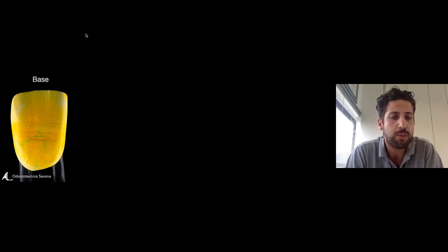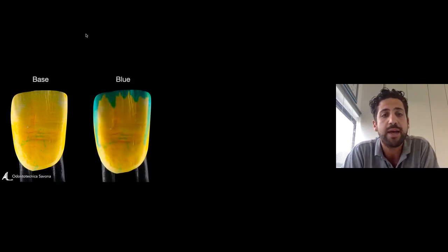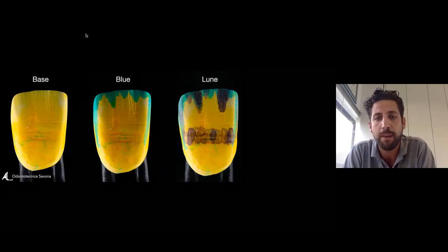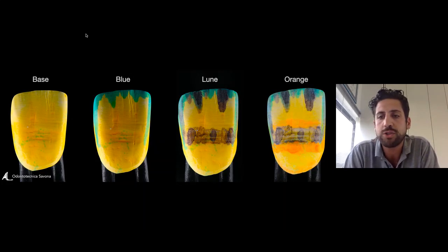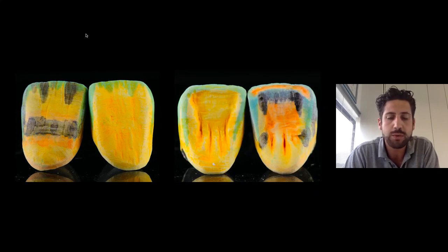For the oldest tooth, the situation is completely different, because we have a low value. Also, the characterization is completely different, and we have the possibility to play a little bit with the colors. For example, we start with the blue. It is always important to put the blue just for the translucency of the material. Then we start to put the lunar or violet. This is a kind of low value color to make the deep effect. We can put, for example, the deep effect between the mamelons, and also in the medium side. And we can put, for example, some orange to make some characterization, to make the tooth a little bit older. This is the difference between the young tooth and the old tooth.